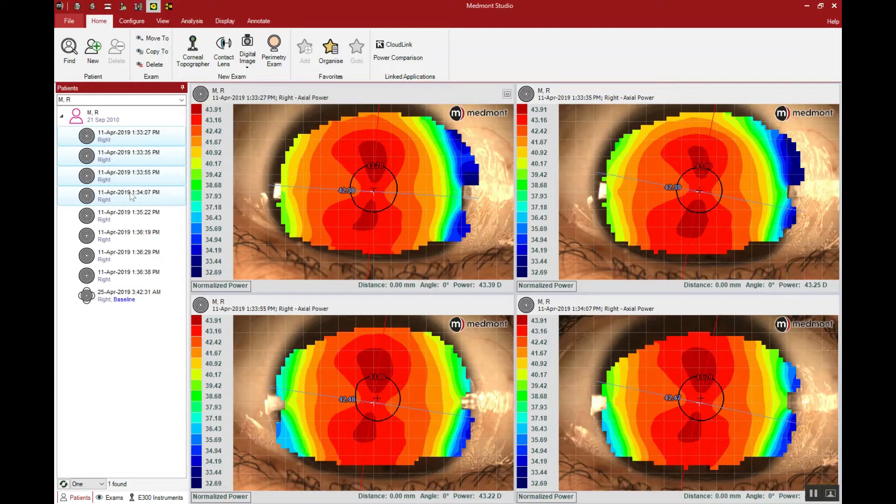Remember that when we take a photo, we're capturing over a moving tear film and a patient that may not be 100% steady — especially kids. Taking multiple maps gives us great confidence that we have accuracy when you see reproducible images. So never take just one capture.